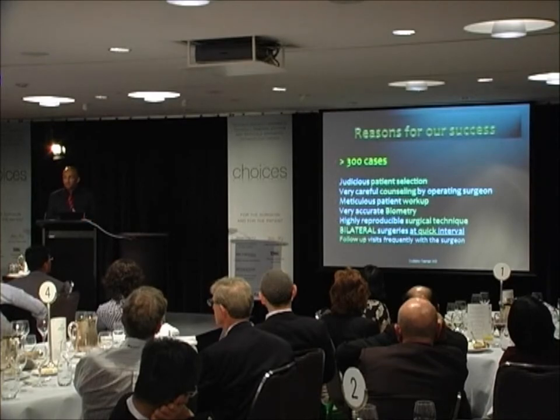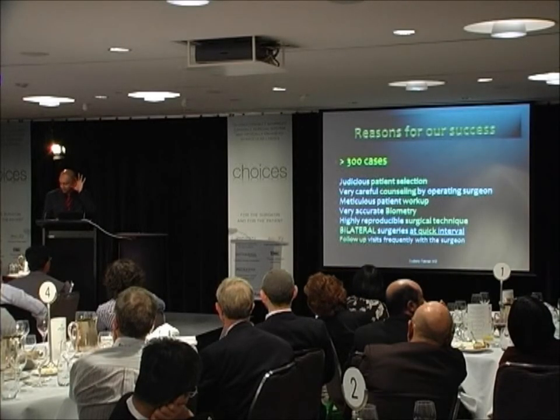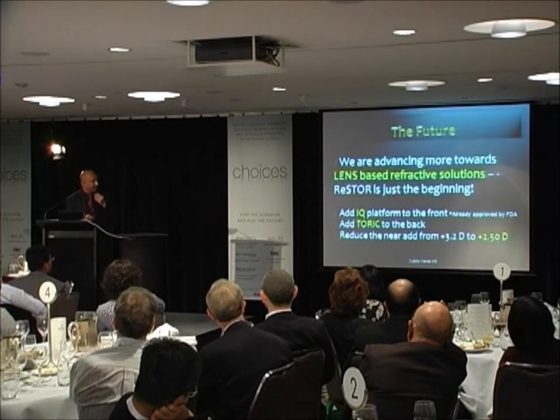So why we have been pretty happy with this lens, and we're still continuing at nearly 20% of our cases with this lens, is that selection of the patients has been very judicious. We're learning to get better at that. Very careful counseling, meticulous patient workup, accurate biometry, high-skilled reproducible cataract surgeries, bilateral surgery at quick intervals, and frequent follow-up visits. That 50-year-old man from London was unhappy because there was no follow-up. We were not there to listen to his complaints. So the biggest factor is you have to have a listening ear, which we don't believe in much.